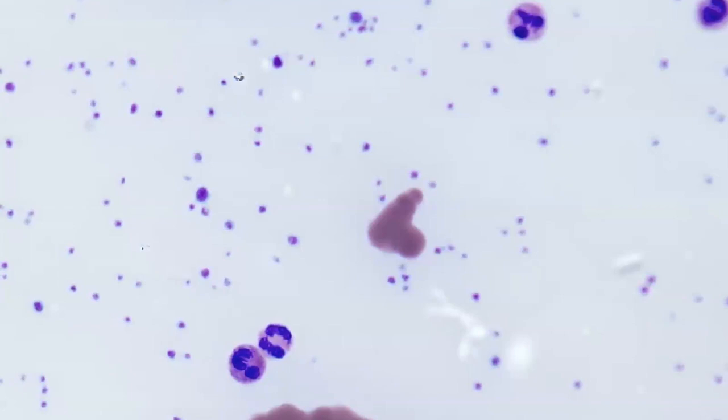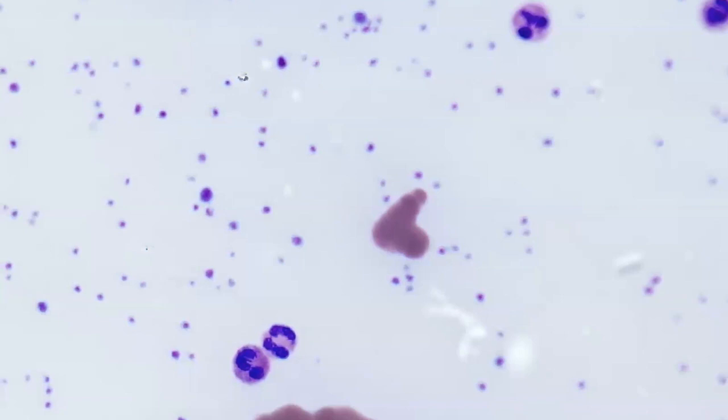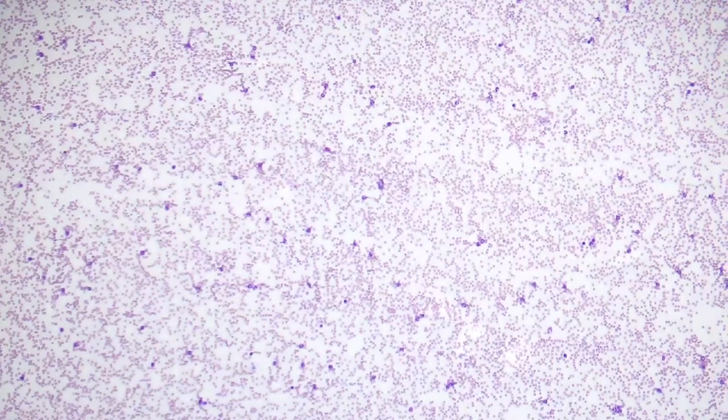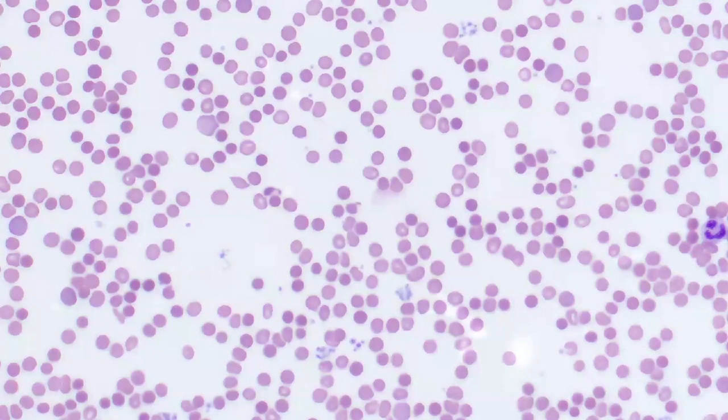And as far as the red cell indices are concerned, in vitro red cell agglutination causes a false decrease in the automated red cell count and a false increase in the MCH, MCHC, and MCV. This in vitro effect can be mitigated by incubating the blood specimen at 37 degrees for 10 to 20 minutes prior to reprocessing for CBC through an automated analyzer. And if we switch and actually incubate this specimen, you can see that the autoagglutination disappears and the red cells aren't forming those dense agglutinations.